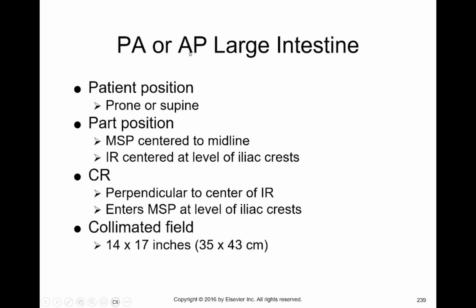So you can shoot PA, but again, I'm going to explain this in the context of AP. When we get to double contrast, we're going to include a PA as a routine. So in double contrast, we're going to shoot AP and PA. But in case your local protocol for single contrast barium enemas is to shoot PA, I'm going to go ahead and leave that in here.